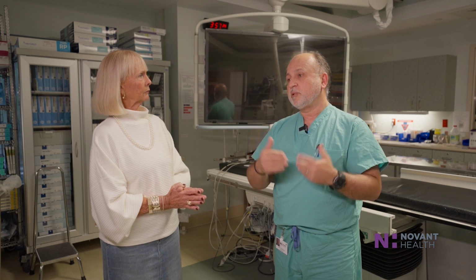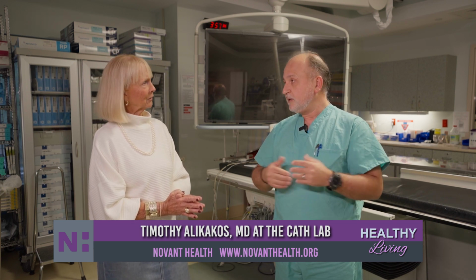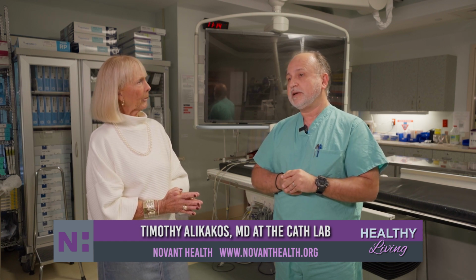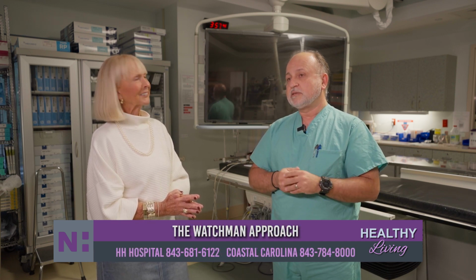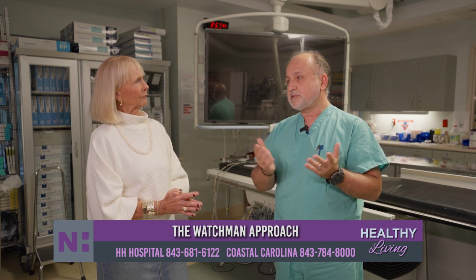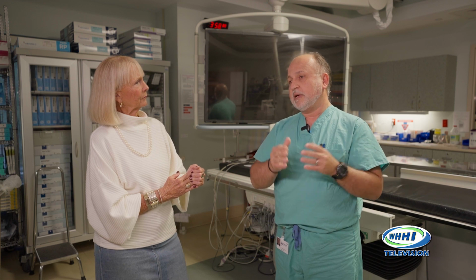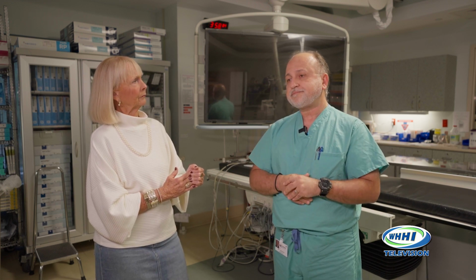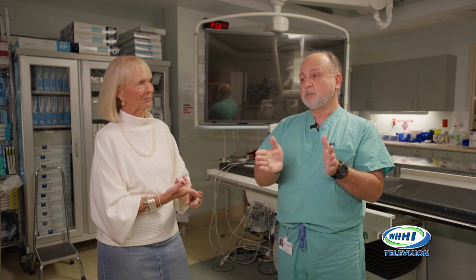What will happen is we bring you into an area such as this, the cardiac cath lab. We give you some sedation to keep you comfortable. We numb up areas in the body where we need to get in. We put in a variety of very small flexible tubes. And through those tubes, we put a little device. It's the Watchman device. It's the left atrial appendage occluder. That goes in a little outpouching or sac in the heart that's responsible for causing probably about 90% or more of the blood clots in the heart. And once we have it there, once it does what it's supposed to do, after it heals over a matter of 1 to 3 months or so, then you're more safely taken off of your blood thinners, your anticoagulants, so that removes the danger of the blood thinner, yet it protects you from blood clots and strokes.